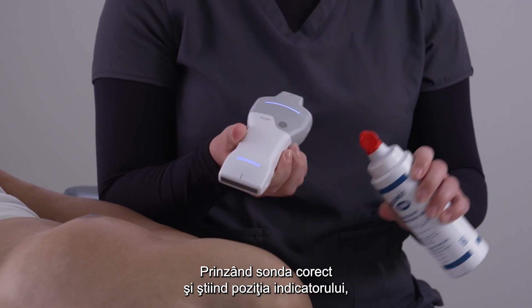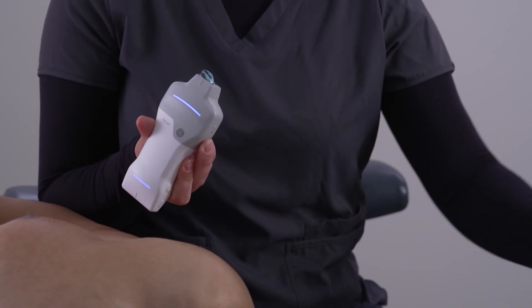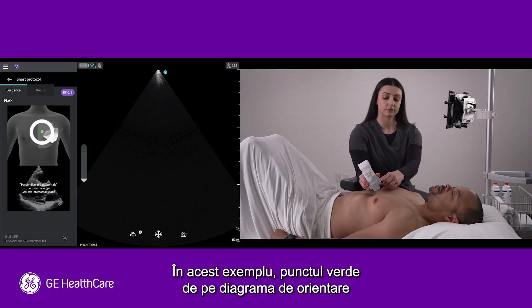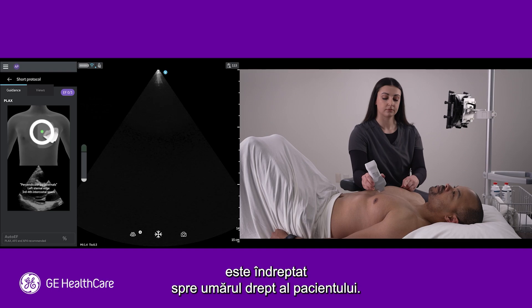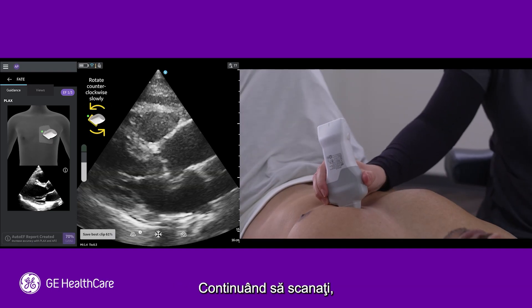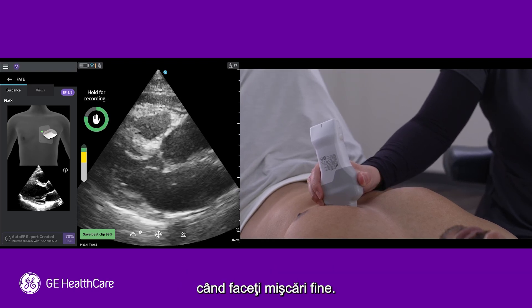With the proper hold on the probe and your indicator located, you are ready to start scanning. In this example, you can see that the green dot on the orientation diagram is pointing towards the patient's right shoulder. As you continue to scan, stabilize the side of your hand to give you more control when making fine movements.